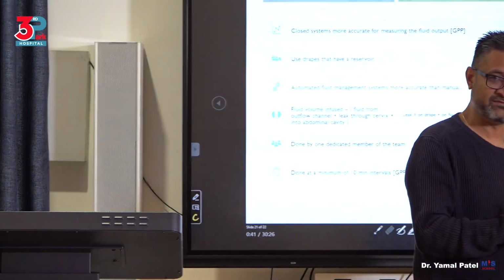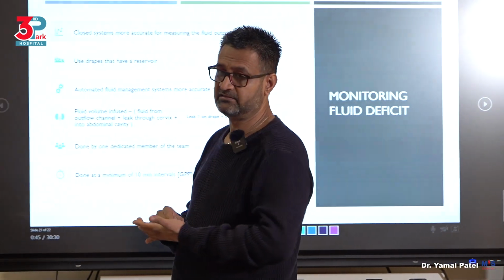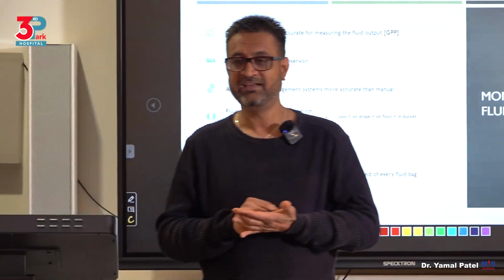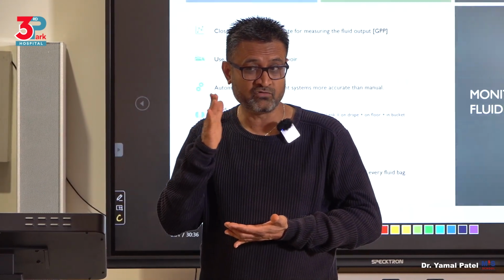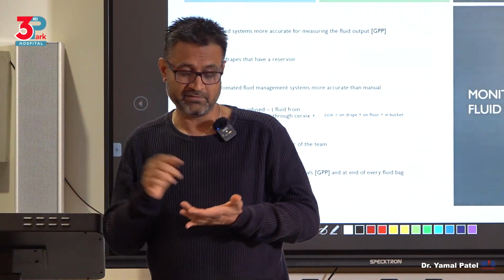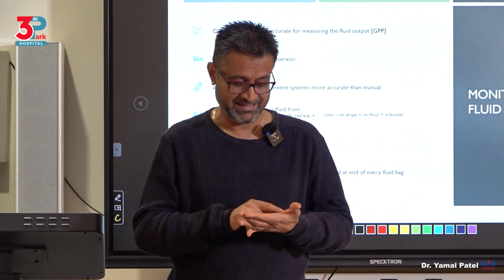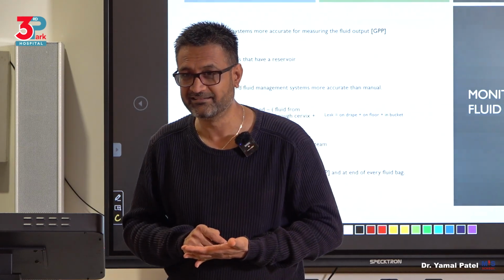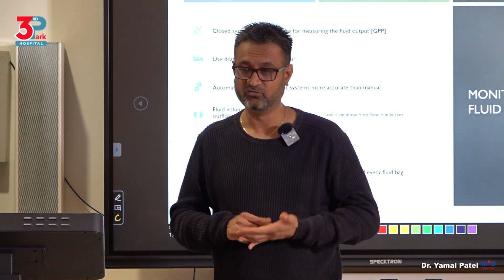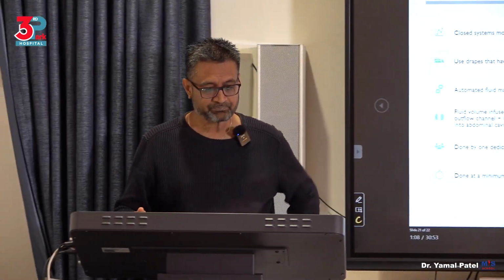After another 10-15 minutes of the surgery: right now 6 liters used, negative deficit 1.2 liters. So you know you're heading towards 2.5. When she says, right now, doc, 8 liters used, I'm missing 2.5 liters, cut off the procedure. End of story. So you get what I'm saying? That is how it should ideally be done, okay?